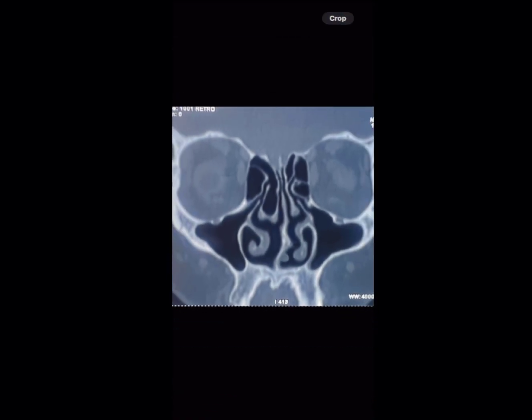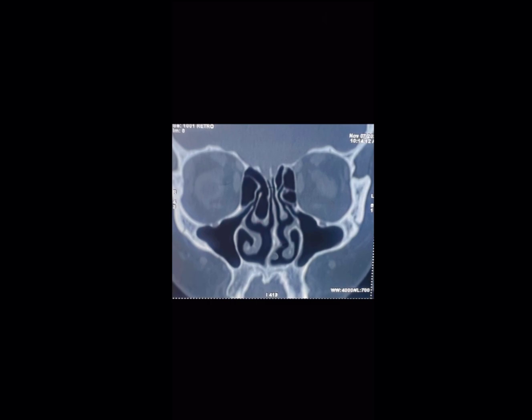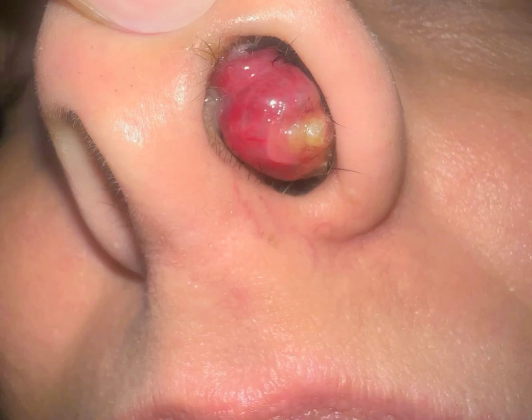With the standard protocol, I did an anterior rhinoscopy, and initially the lesion was very small, arising from the midline, that is the nasal septum, and it was congested all over with crusting on the apex because of exposure to dry air. Post that, for proper diagnosis, I did nasoendoscopy and could find the septal spur, as I already mentioned. So on clinical examination, I immediately assumed that this could be a case of nasal vascular mass.